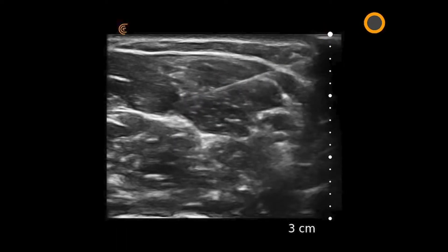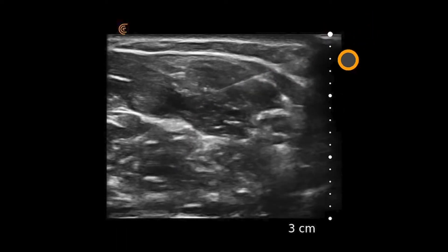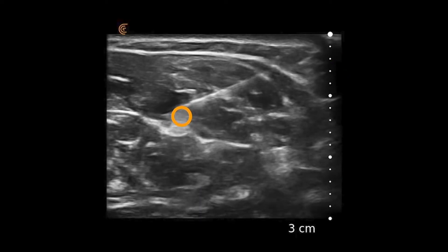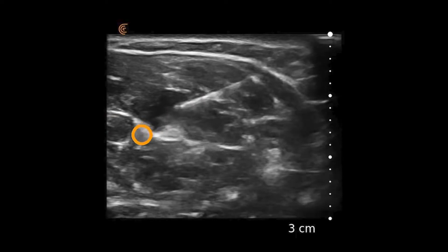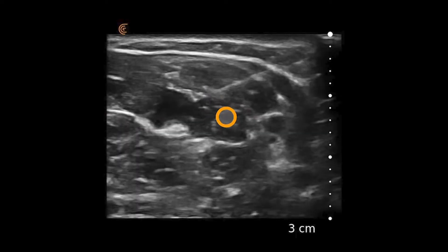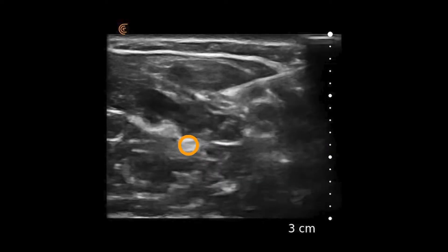This is a 25-gauge needle in the longitudinal plane, visualizing the entire needle and the tip, and visualizing the spread of anesthetic initially on top of the median nerve, which can be identified in the center as a honeycomb structure.